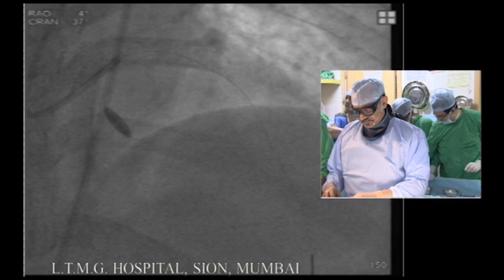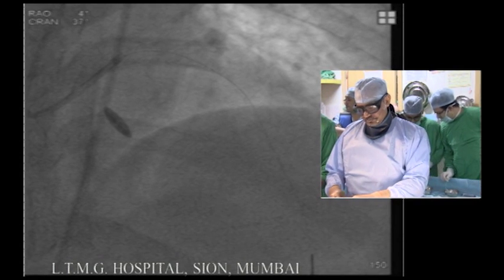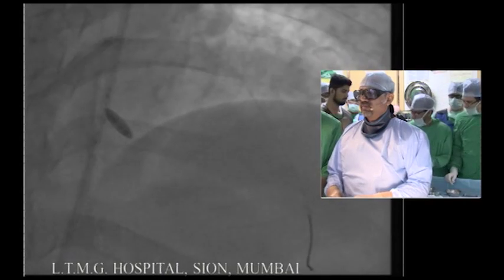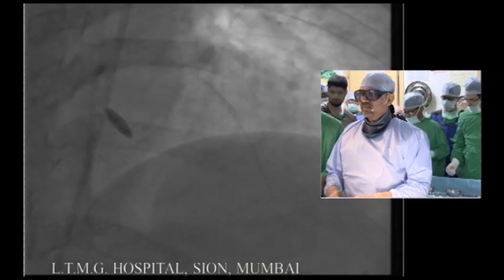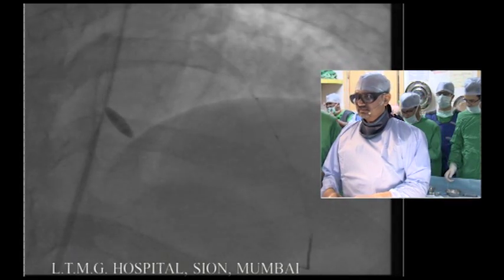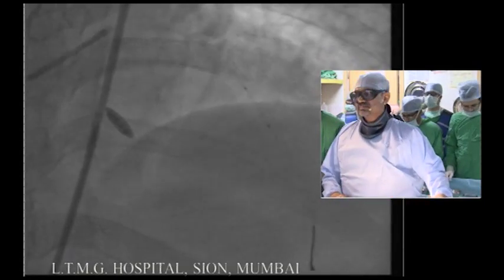That's okay. I would take a small, low-profile balloon just to create a passage for the IVUS catheter and also see what that diagonal is. It is not so small as we think. There is nothing else going to that territory. And your balloon went very easily, so I think the lesion is not as tough as we thought.